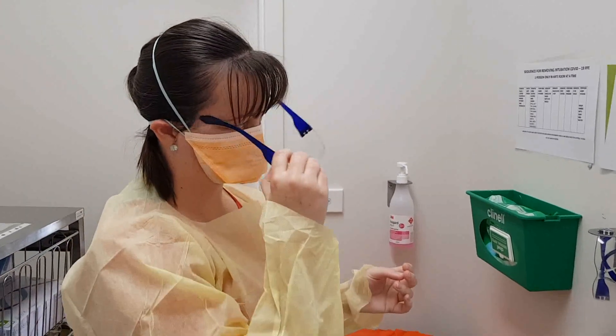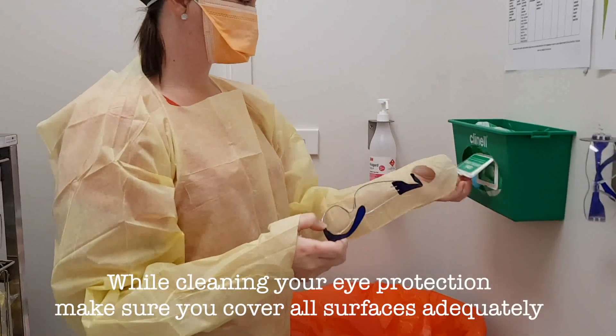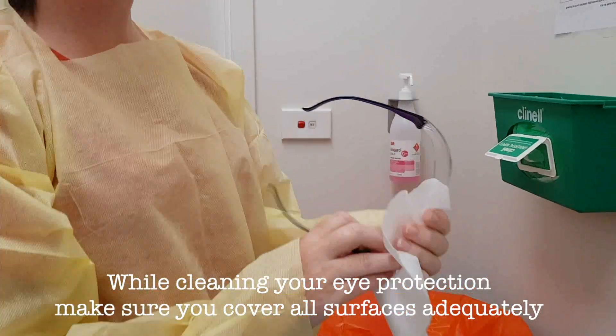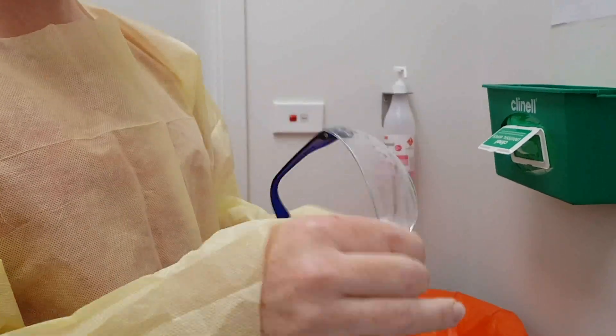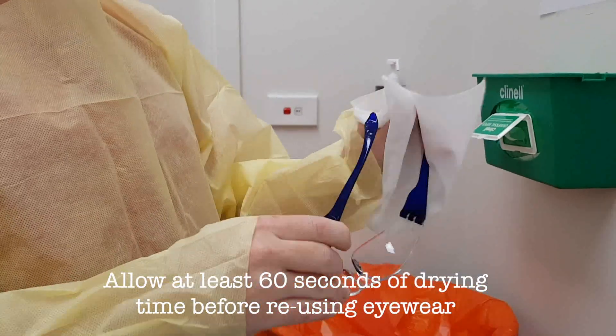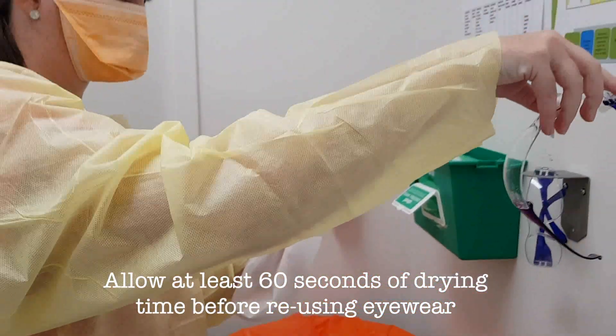Remove your eye protection and clean it with a Clinell Wipe, making sure that you cover all surfaces adequately. Then allow drying time of at least 60 seconds to decontaminate before reusing.